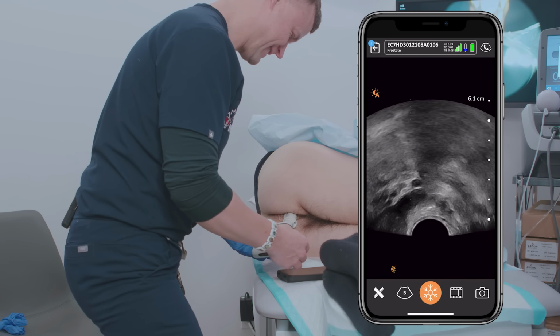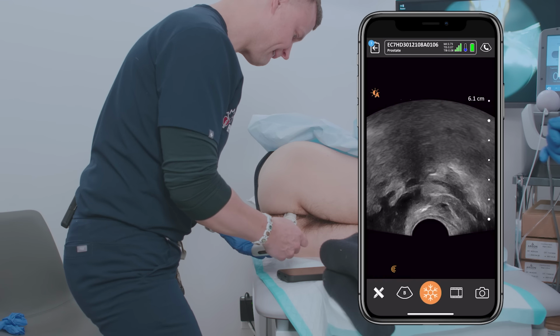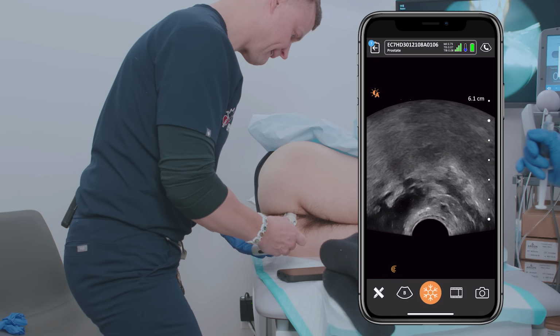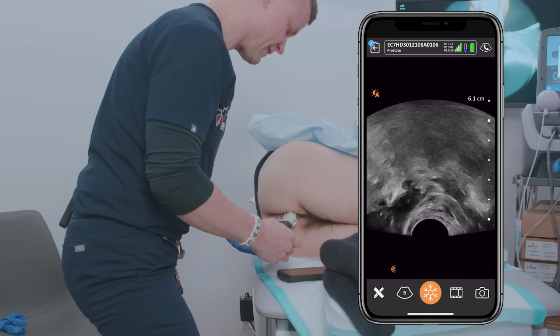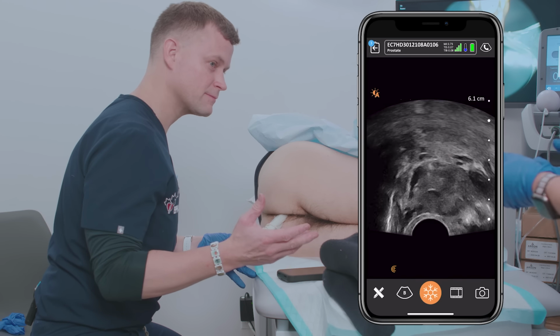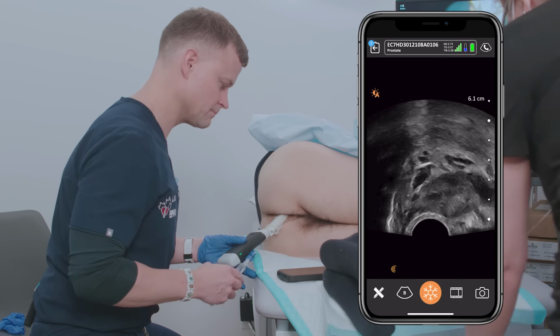So again, entering the contralateral seminal vesicle and piercing through the seminal vesicle and doing again the same technique above the seminal vesicle on the contralateral side, keeping in mind not to enter the venous structure and the structures around those anatomic features. And now bringing our attention to the apex, which often is not always addressed and is very important, certainly with BPH procedures such as Rezum.